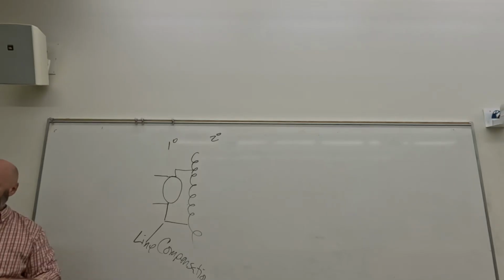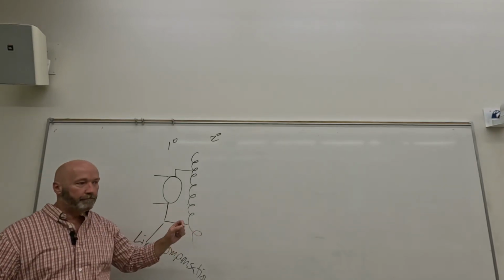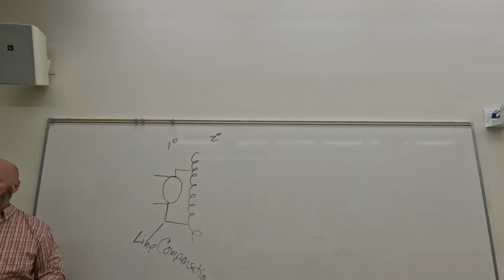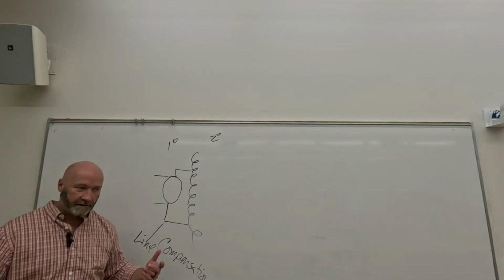Because it controls penetration, it controls quality, right? In the x-ray tube, it controls how fast the electrons travel across the tube. The higher the kVp, the faster they go, the more kinetic energy they have, and the more kinetic energy they have to lose, and therefore we create higher kVp x-ray photons.